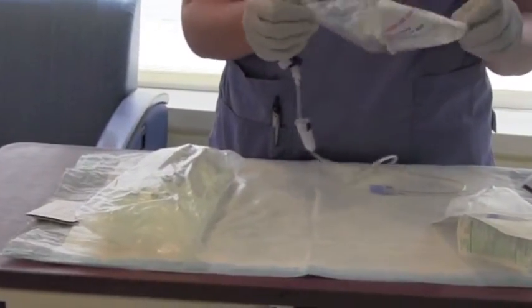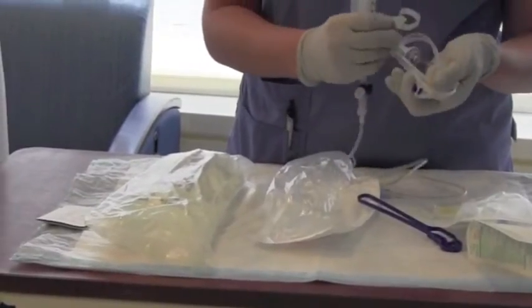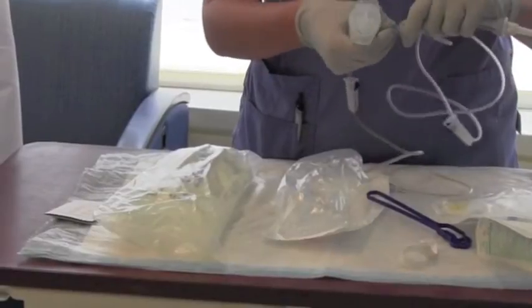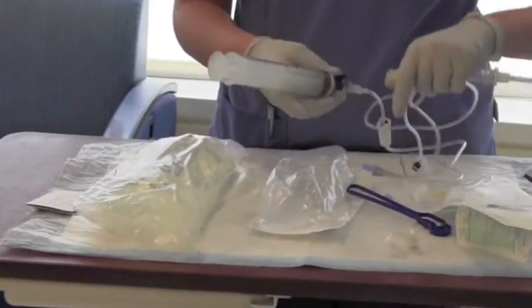And then you're going to grab a secondary set, and make sure you grab the right secondary set, because there is another set that looks similar to it. This has the shortest amount of tubing, which will get the fluid into the patient that much quicker.